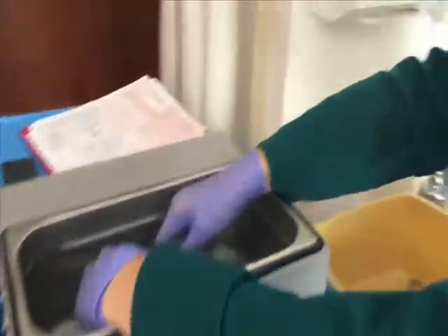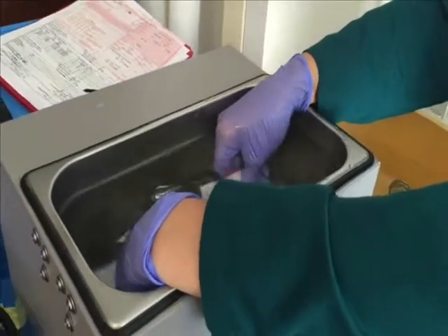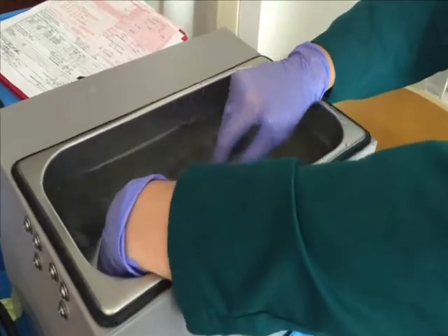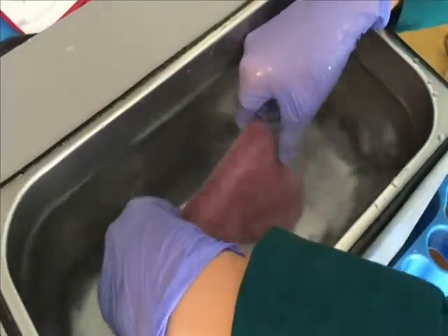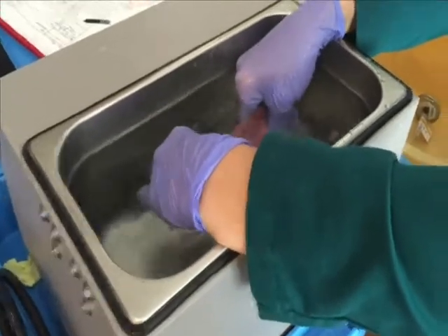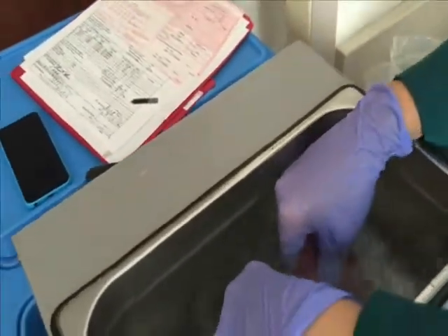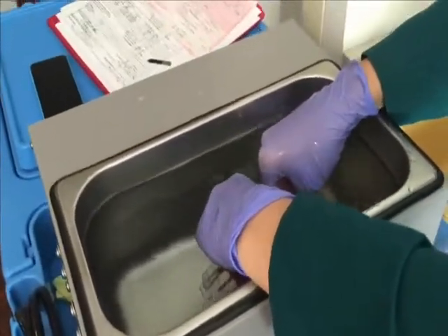So how long does it take to thaw, about 5 minutes or something? Usually around 3. Not too bad. This is a pretty big bag though. They range from like 40 milliliters to around 90. 90 is probably the highest we go. This one is about 75. So 2 bags of 75 milliliters, and she's getting 8 million, 4 in each bag.